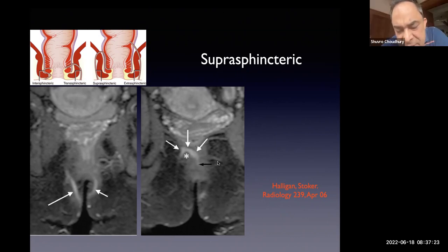So it is because, remember, this is not a T2, usually it's a fat suppressed image. So it is more difficult to see, but you will see the dark fibers of the levator plate going like this very clearly on the coronal plane. And on the axial plane, when you go up to that level, you will see it. On the coronal plane, you will see the levator plate in every image. So the levator plate is somewhere here.